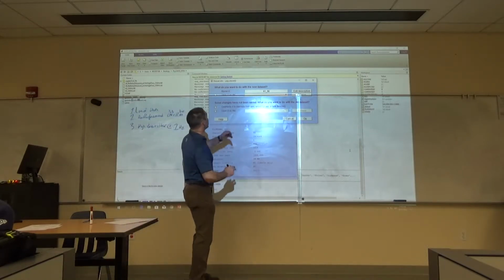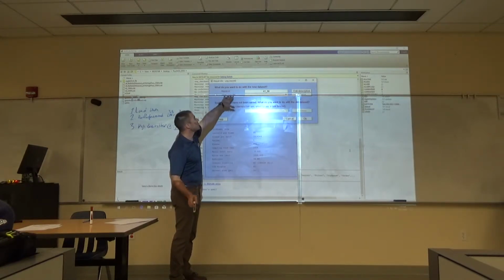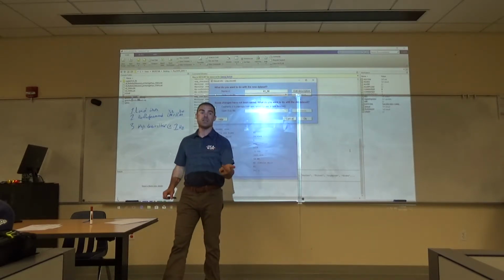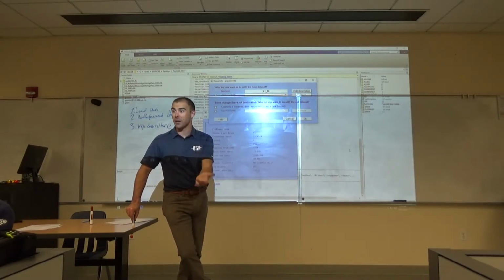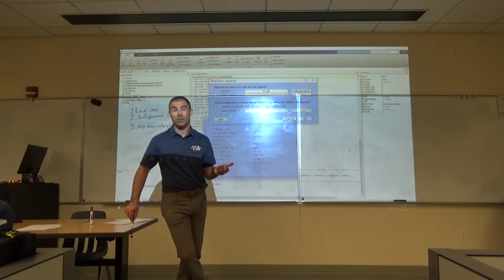Okay, and now it's going to ask us, okay, we did what you wanted to. What do you want us to do with it? Now we want to name it or save it. So we're going to do a little bit of both. And the reason we're going to both name it and save it is because if we save it, then we don't have to go through this process again if it crashes. We can just load it in and start from where we left off, which, as you guys can understand now very well, is a nice perk, right?